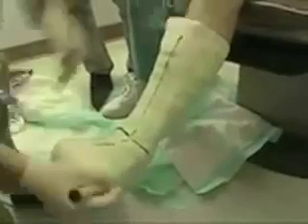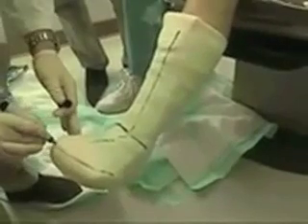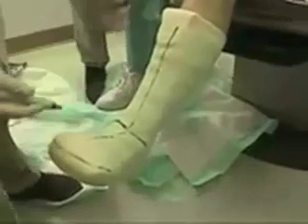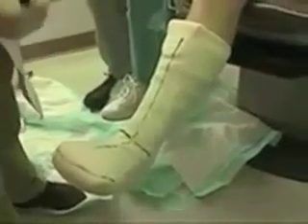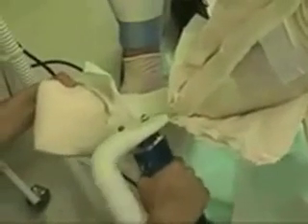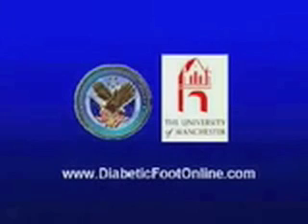What you see being done here is the application of cut lines. When we typically cut off the contact cast, we will do so anteriorly and at the ankle, along areas where the felt padding is already existing. This will avoid any abrasions or cast burns. Once the cast is removed, we are ready for our next cast application and ultimately on the way to healing.